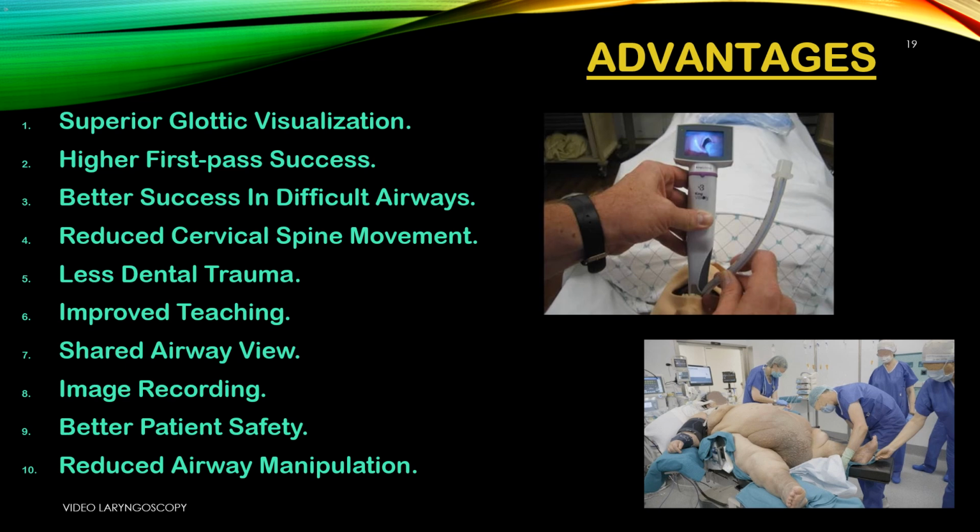4. Reduced cervical spine movement. You don't need to extend the neck much. Safer for suspected spine injury. 5. Less dental trauma. Less force needed to lift the tongue. Fewer broken teeth and lip injuries. 6. Improved teaching. Trainees can watch the screen and learn technique in real time from the operator's view.